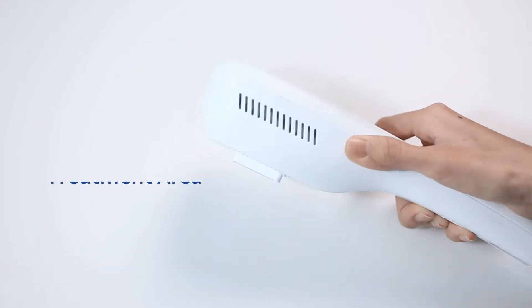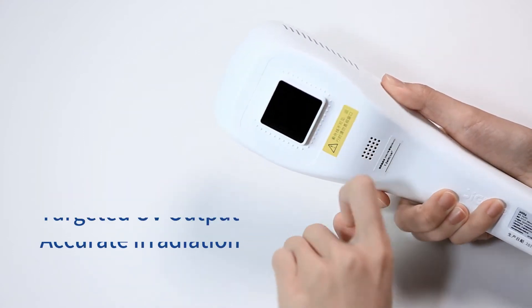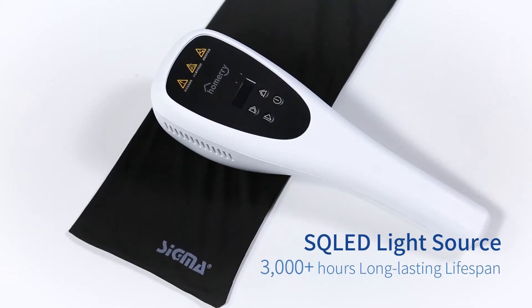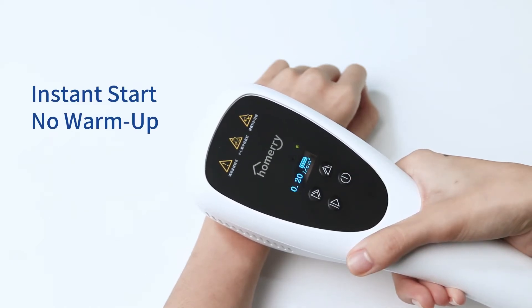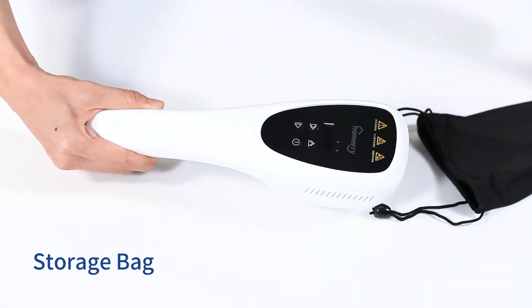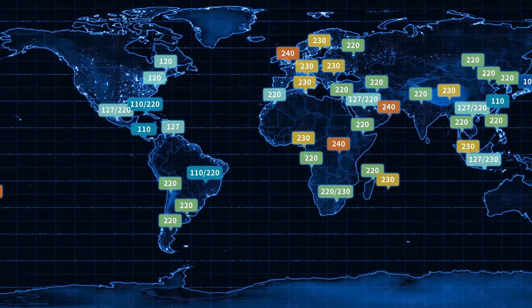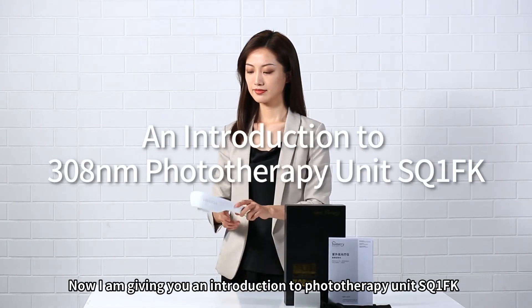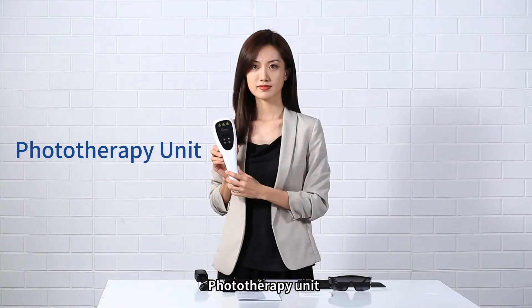Thank you for joining us. I'm giving you an introduction to the phototherapy unit SQ1FK. Packing list includes the phototherapy unit.